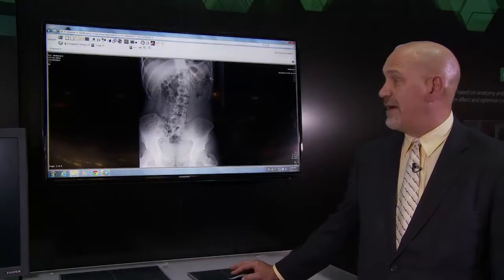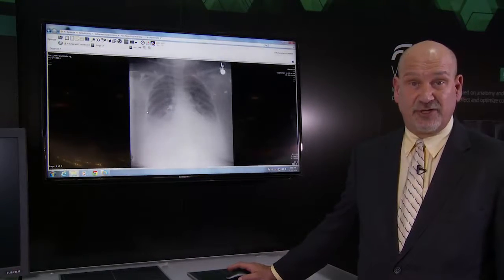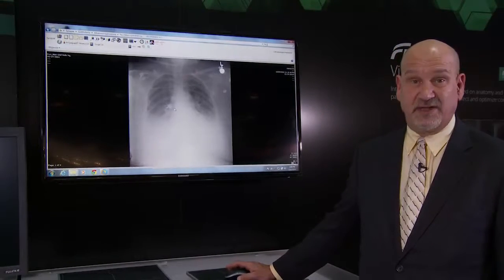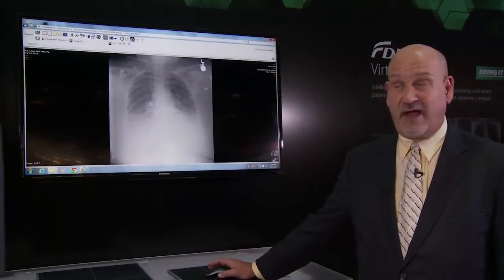Here's another example of virtual grid for a portable chest exam — a very large patient acquired without an x-ray grid. As you can see, the scatter content is having a significant degrading effect on image quality.